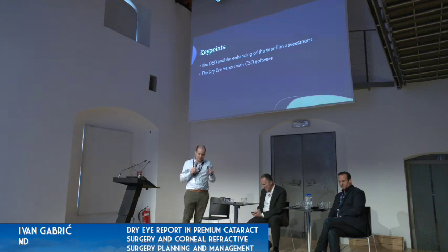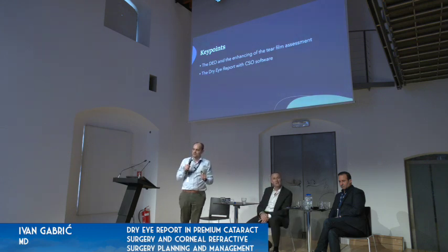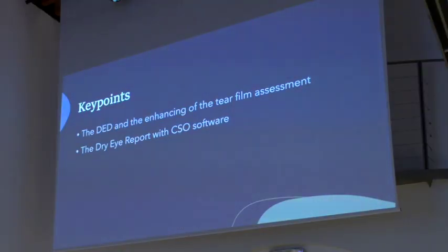You can never underestimate the quality of you giving something to your patient before surgery. And my entire way of thinking about anything has changed. For keratoconus patients, I guess you probably always print out their Pentacam and you tell them, take it with you. Now I do not just that, I print off the ocular simulation of their vision. And I do the same with dry eye patients.